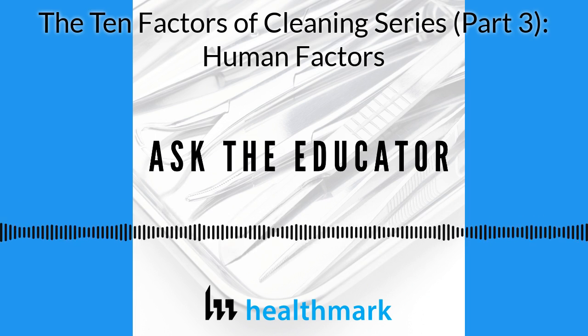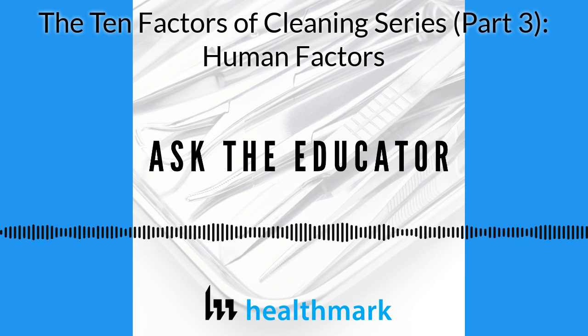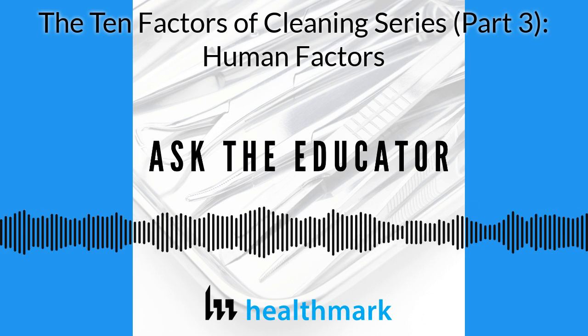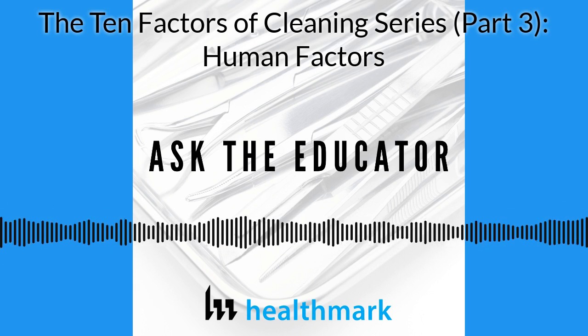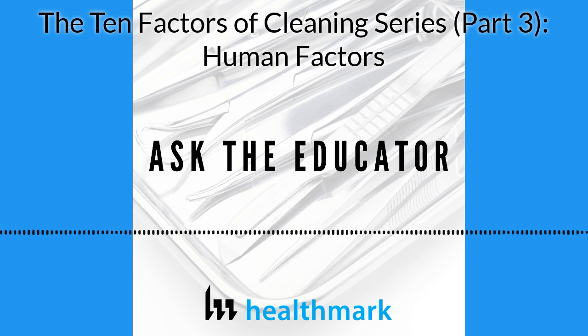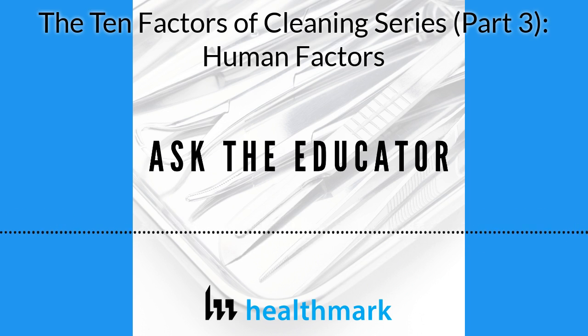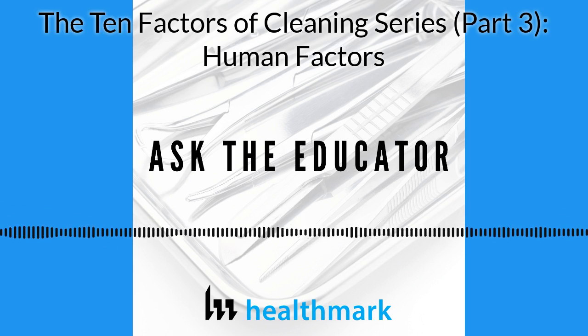We're not robots, right? We can't pretend that we aren't emotional beings and that our emotions don't affect our work. Also, we're not computers. You can't just download the latest IFU and start automatically processing the instrument correctly. Human factors are always something to investigate when you're trying to solve a dirty instrument problem.